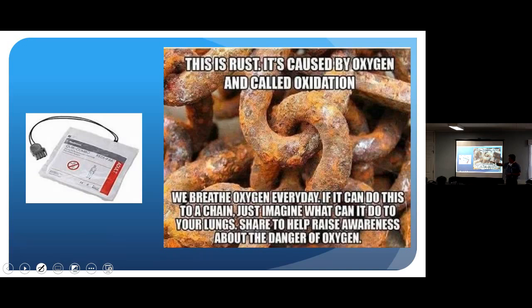The other thing I throw on my STEMI patients is the defib pads. The things that kill you early in a STEMI are dysrhythmias, VTach or VFib, or some kind of heart block, right? So if it's just you in the back of the truck, you're heading down the road and they go into VFib and you've got your pads on, you charge to 200 and you shock them. If not, you've got to pull over, start CPR, start bagging, so it buys you time. You can't put pads on everybody. Your boss will fire you. They cost money. But STEMIs should get defib pads, all right?